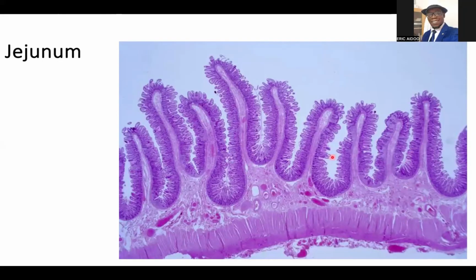Another type of micrograph, jejunum again, with submucosa going into the core, forming a plica. Very, very beautiful outline. And you have some of the submucosa that didn't go to form the core of the plicae, so it stays at its position, and the muscularis externa.